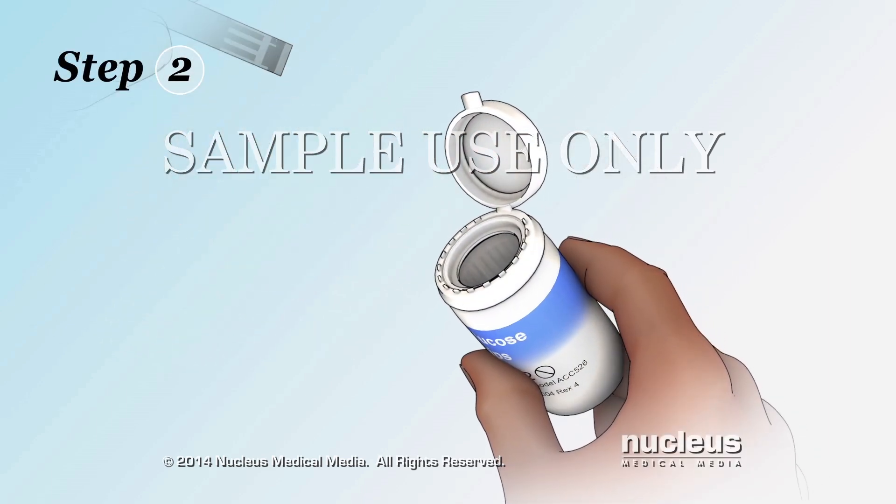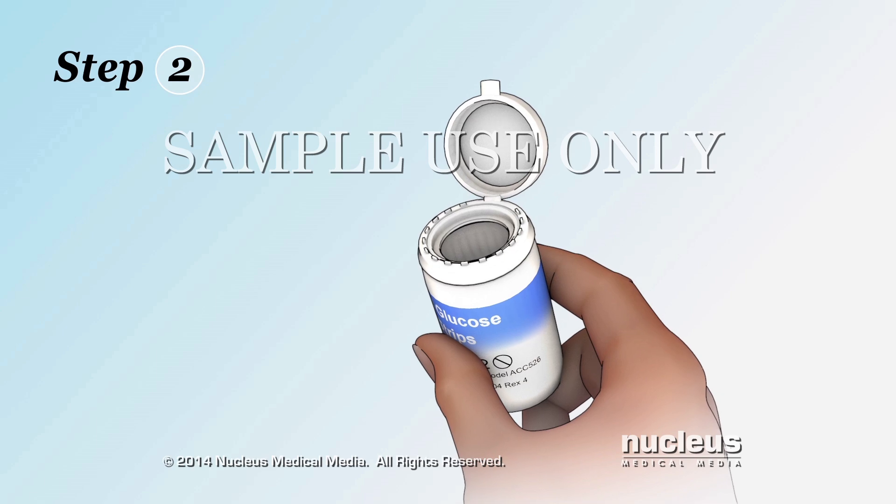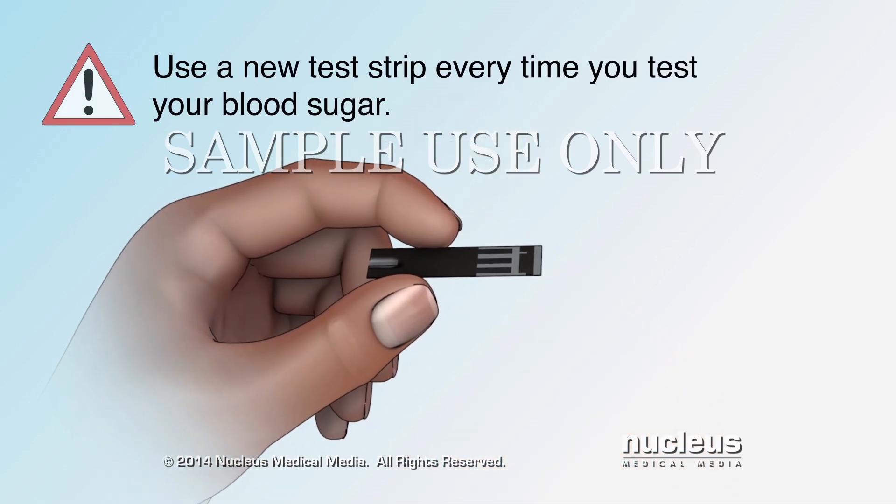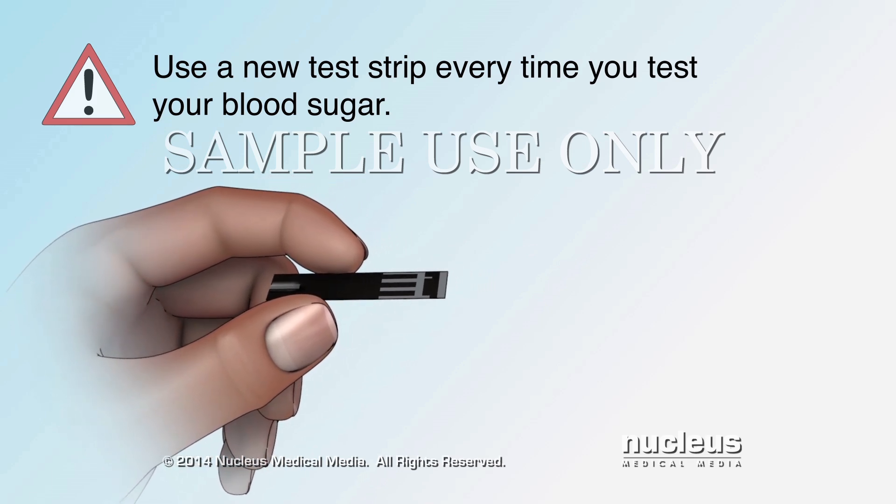Step 2. Remove a test strip from the container and put the cap back on to protect the strips. Be sure to use a new test strip each time you check your blood sugar.